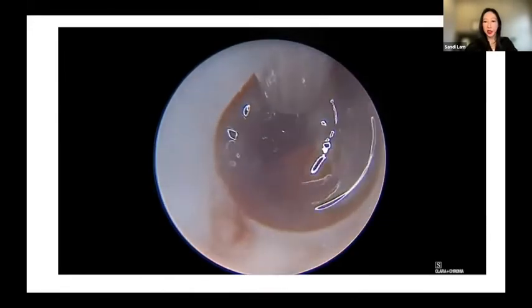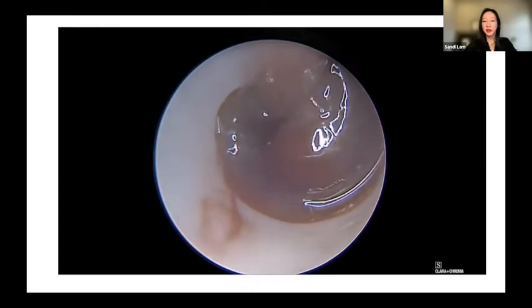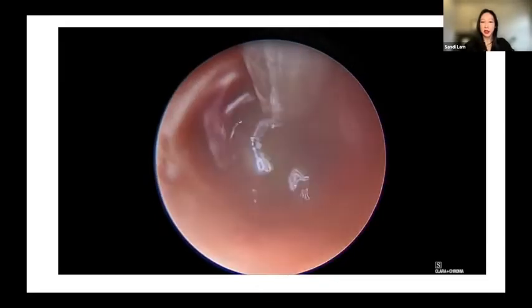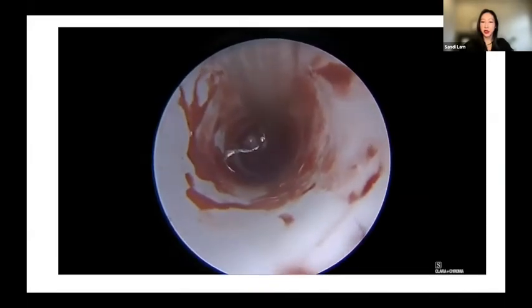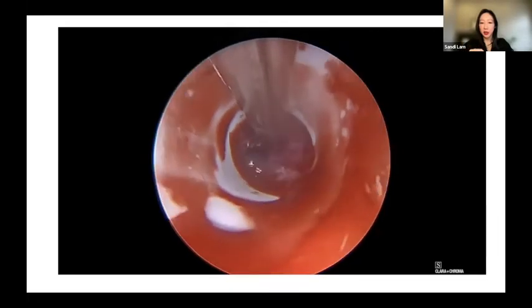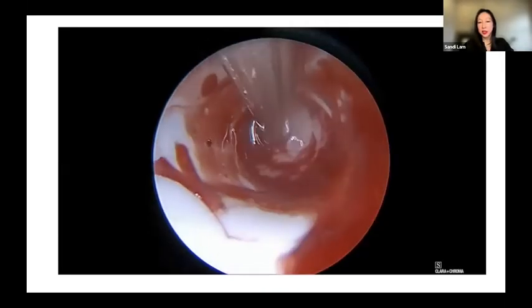And as our Japanese colleagues show, in adults, evacuation of intraparenchymal hemorrhage done in a controlled fashion can be very, very effective. I learned from our colleagues on the adult side, especially in the neuroendoscopy world, and really adapted this for a baby, using a transfontanelle approach. And then you see that ultrasonic aspiration that can really help us visualize and to be able to do that without the morbidity of a craniotomy. So that's kind of what that looks like.